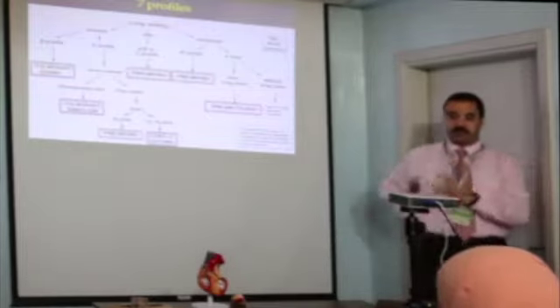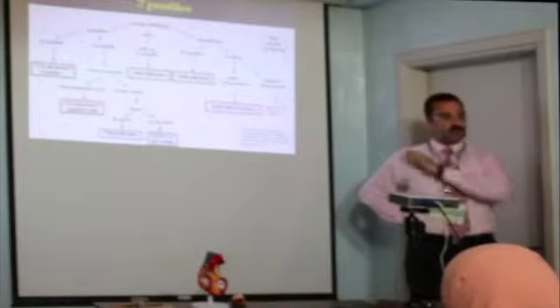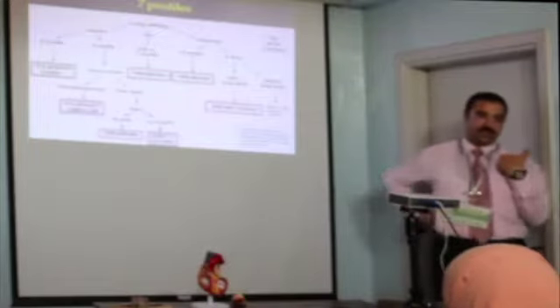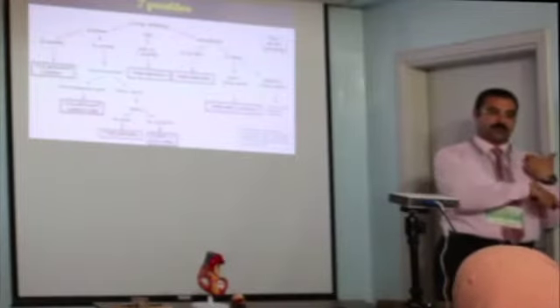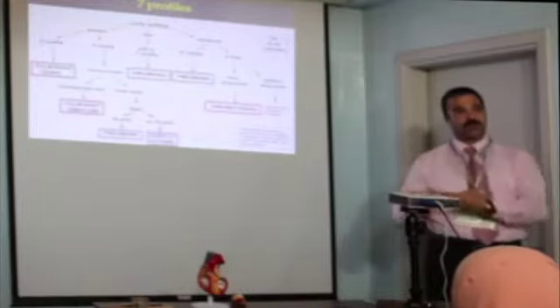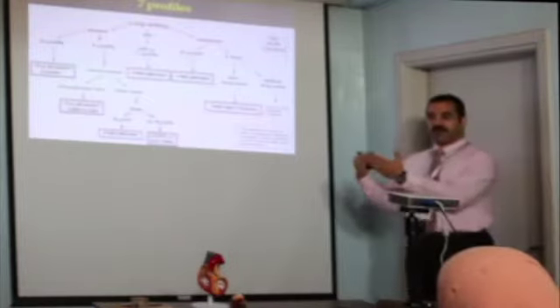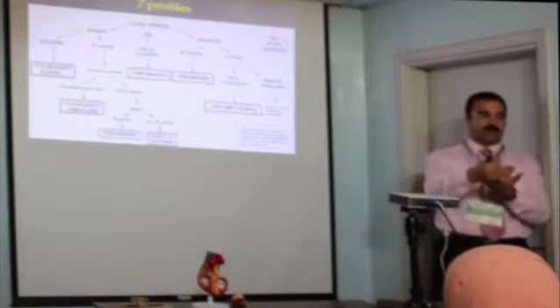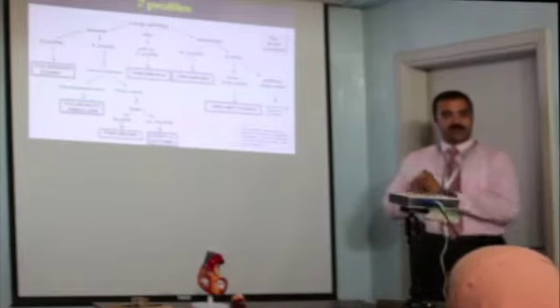There are new protocols coming to recruit patients under ultrasound guidance, which is really marvelous. They see the aeration in the apical lung zones and in the basal lung zones, and they guide the recruitment by these. And after the recruitment, they check for pneumothorax. So respiratory therapists are using ultrasound in their protocols. They scan the atelectatic lung zones in the back, start doing chest physiotherapy, and then scan afterwards, documenting their therapy, how effective it was, how the picture improved. So it's better than, again, shooting in the dark. Convinced?